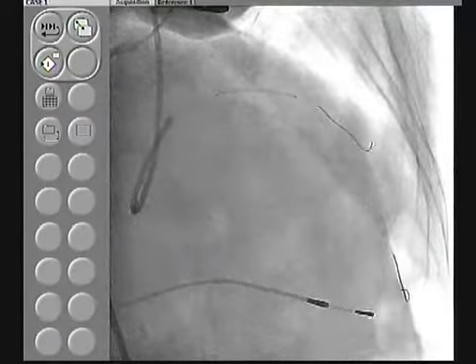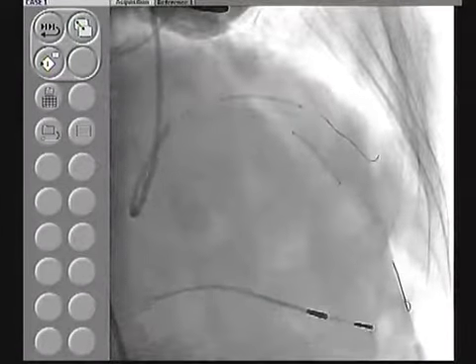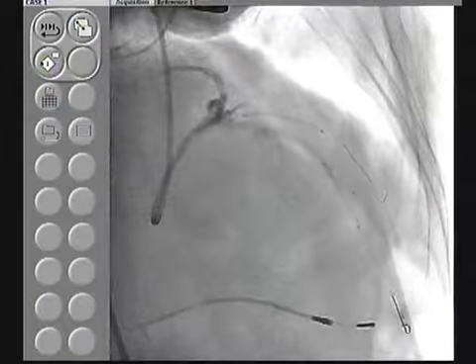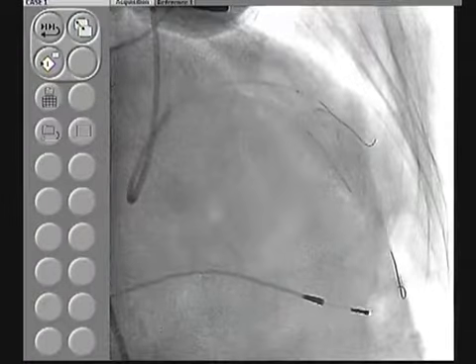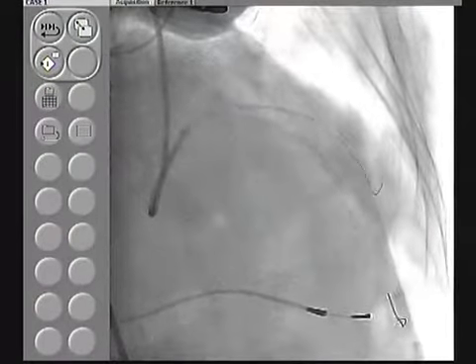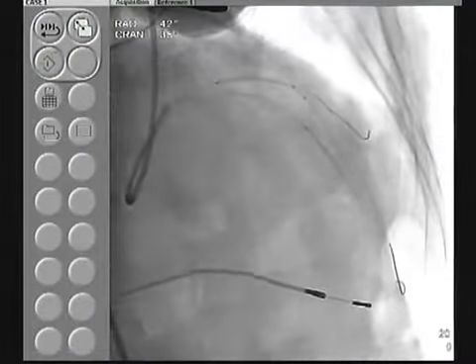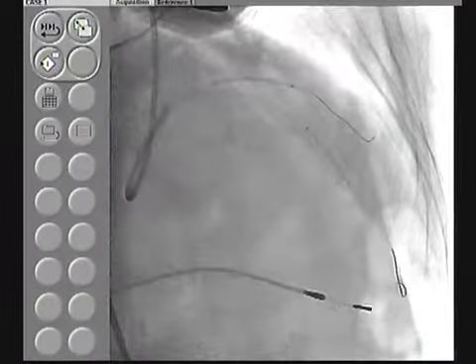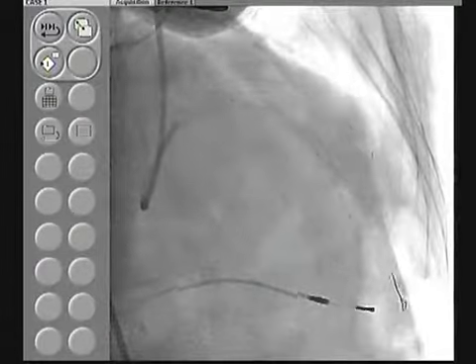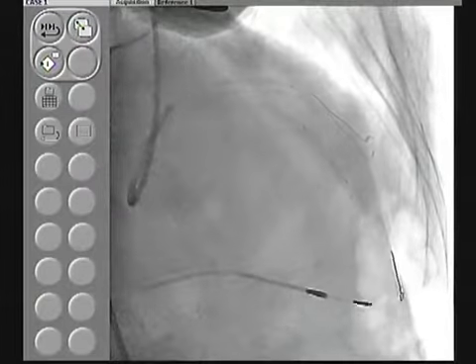Now once you're putting 2 stents, although they can go through the 6 French, we are putting a distal first. That's what we decided. That's good. But do we need a 28 for the distal? Didn't we say before we do the bifurcation, we are doing the distal? It's good. I pull back, 1 millimeter only. So this is a 3-0 Promus, 3-0, 28, 23. Got it. We go up now.